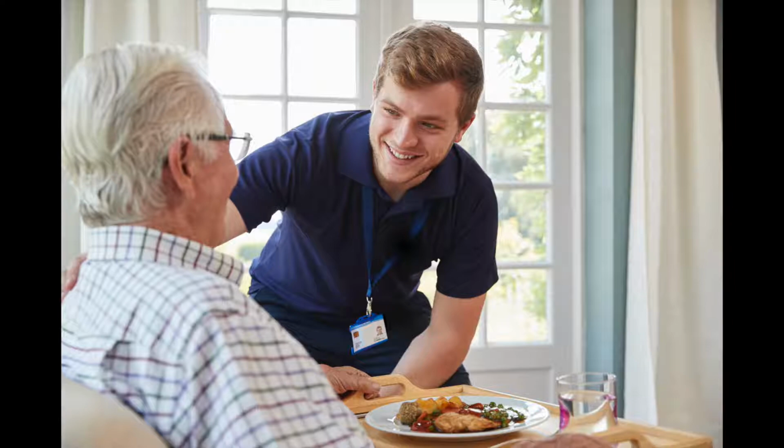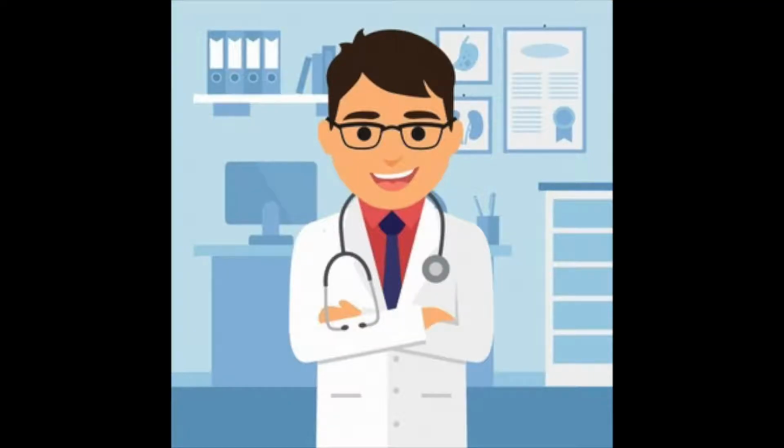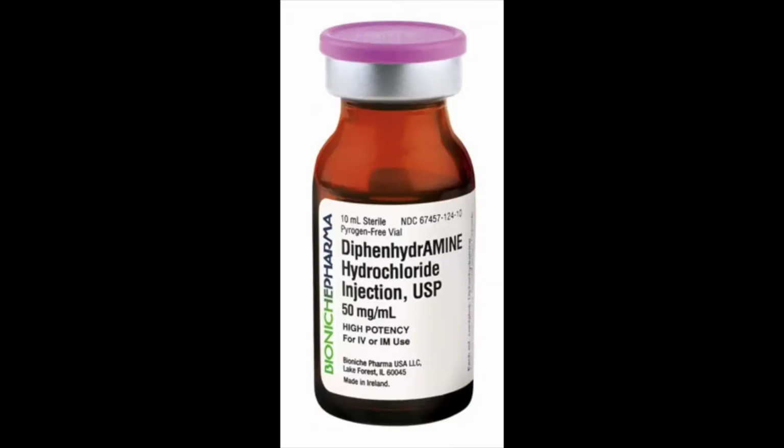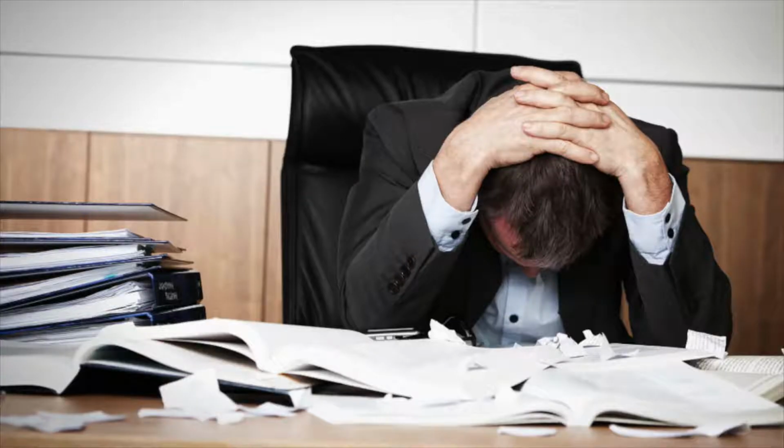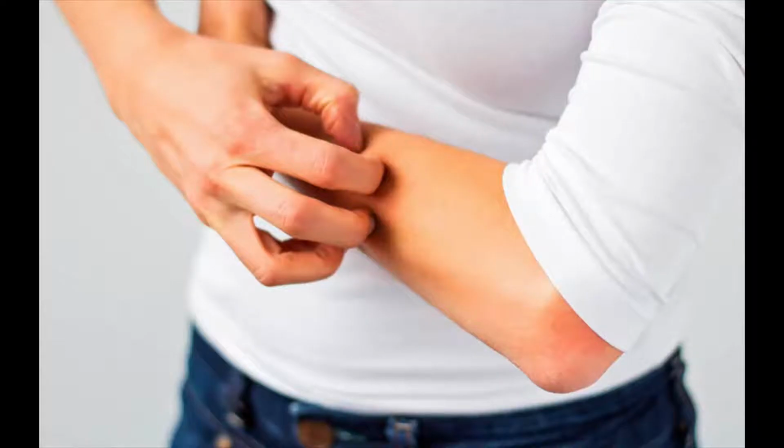For example, "Hello, my name is Joseph. I'm one of the medical assistants here in the clinic today. Can you tell me your name and date of birth? Thank you. Here with me today is my clinical supervisor. His name is Dr. Malik. As you probably know, your provider has ordered a medication called Benadryl to be given by injection into your upper arm. Do you have any allergies to medications? Have you ever had this medication before? Were there any difficulties with this medication in the past?